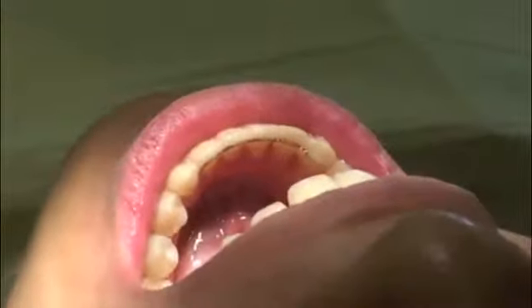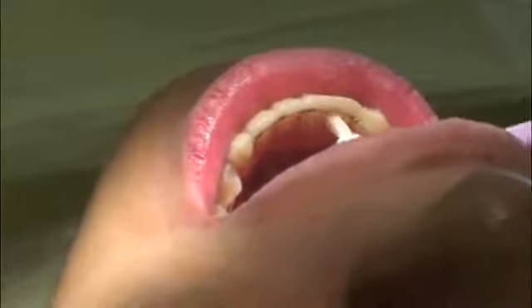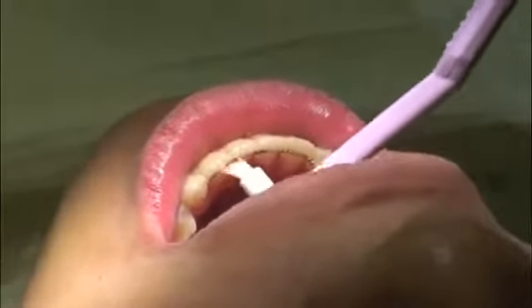It is very important to keep the bonded retainer wire clean. Make sure you brush all around the retainer wire with your normal toothbrush. In addition, we have provided you with a sulca brush. This little brush has small bristles which are excellent for accessing underneath the wire. Push the sulca brush up against the gums between the teeth next to the wire and vibrate the sulca brush in a circular motion, as you can see here. Make sure you do this for every contact point adjacent to the wire.